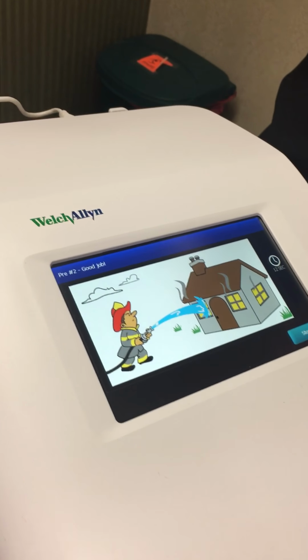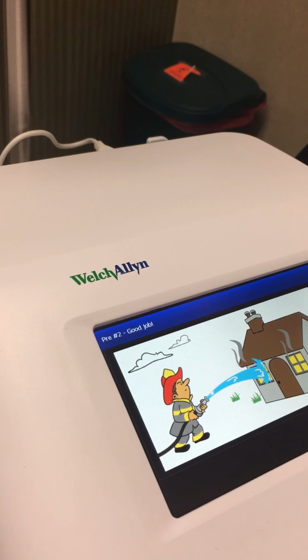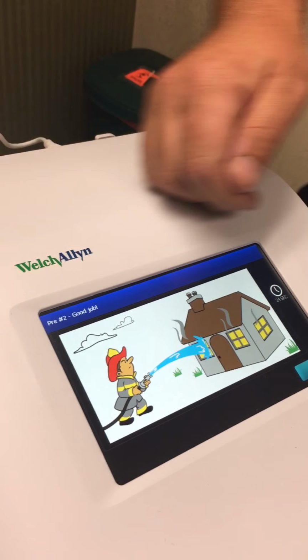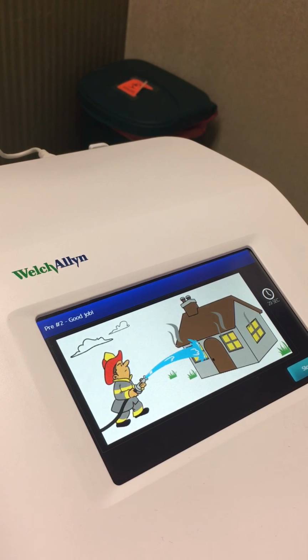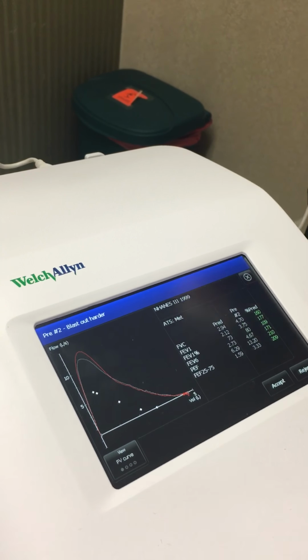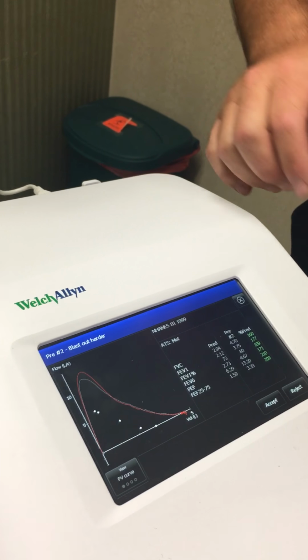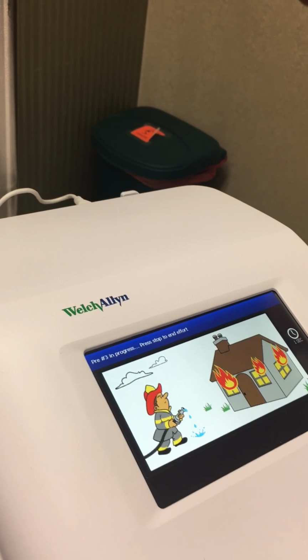Now that whole time I'm blowing, even though it doesn't sound like any air is coming out, I do not stop blowing. That's your job. Yell, go, go, go, keep going. You've got to be the cheerleader to get them to keep blowing. Nine times out of 10, 10 times out of 10, the first time somebody does this spirometry test, they're going to do the initial blast and they're going to stop. Once you're out of air, it's unnatural to keep trying to blow, but that's what you've got to do. So let's start pre-3.